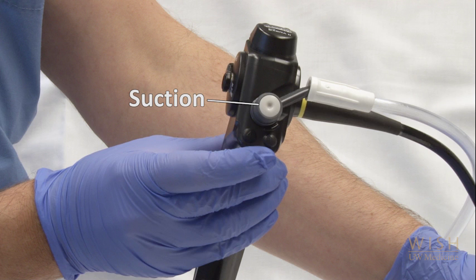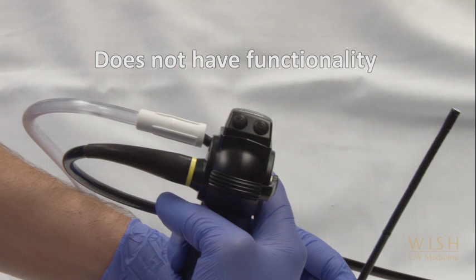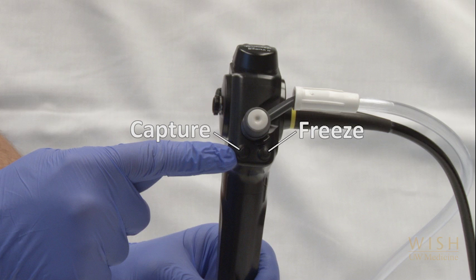There are several buttons on your scope. First, the suction button, which you've just inserted — suction is not applied through the bronchoscope channel until you push this button down. The two buttons on the back of the scope, labeled 2 and 3, do not have functionality on this bronch cart. The two buttons on the front of the scope head are near your index finger while holding the scope; this will freeze the image on the screen and take a picture to record that image.